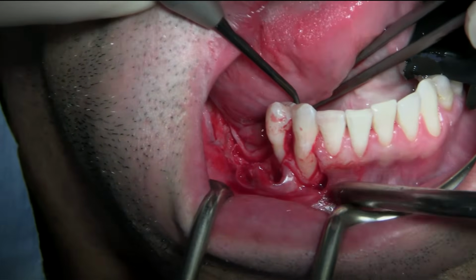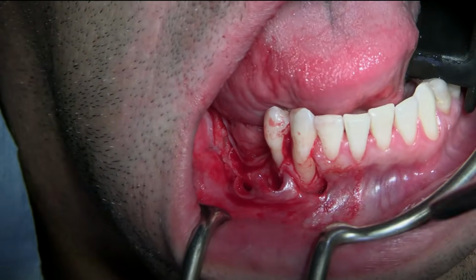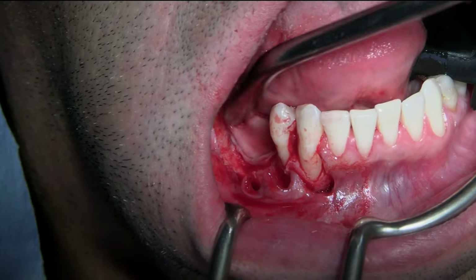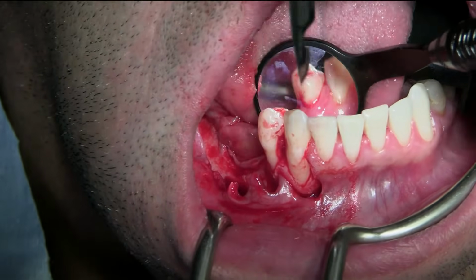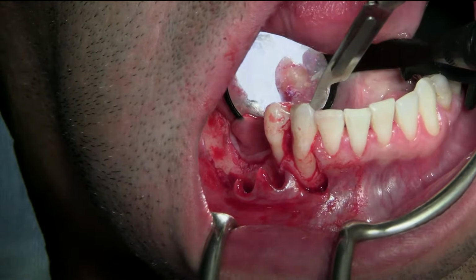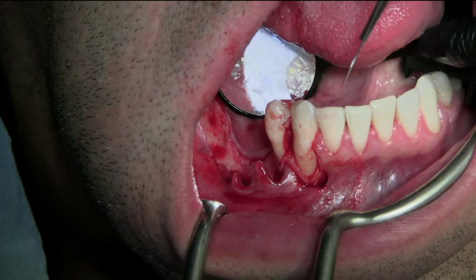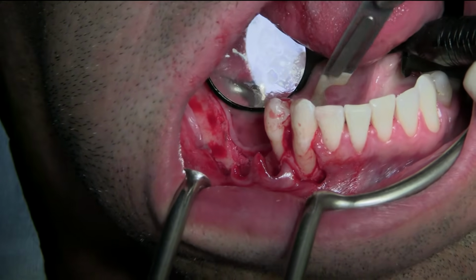We have a 15C and a mirror. No, it's small. We'll go circular. I don't think we can see behind the tube. We can't see any visual behind it.